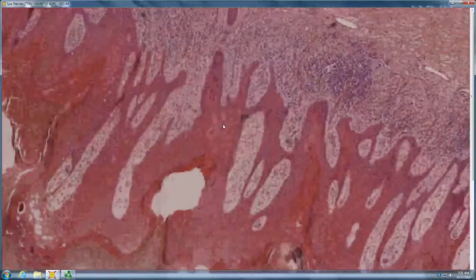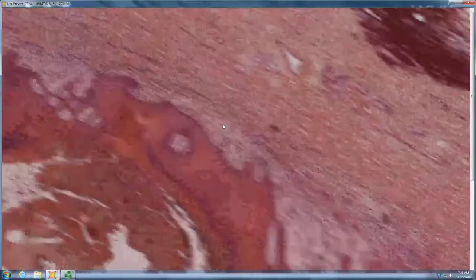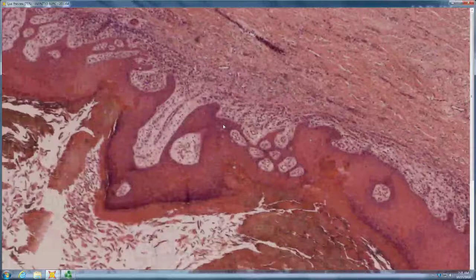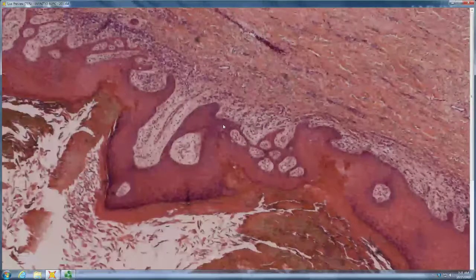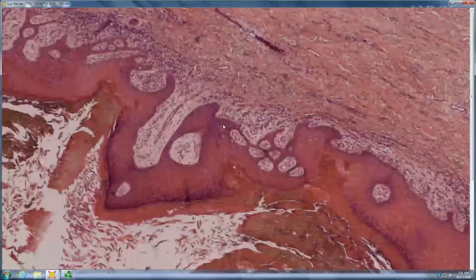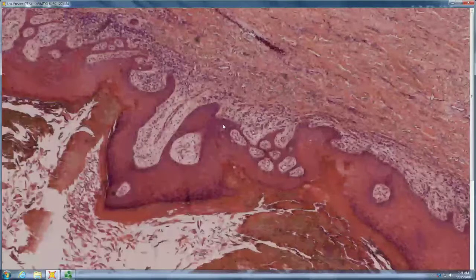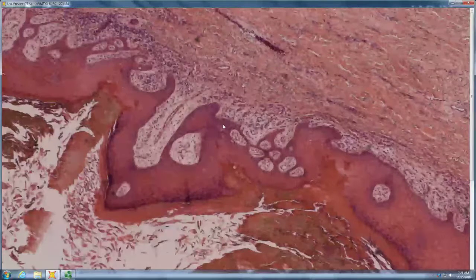Maybe it's like porokeratosis ptychotropica. Ptychotropica, that's exactly what it is. So porokeratosis ptychotropica, we've seen patients here with it. It's often a brownish gray fixed psoriasiform plaque on the buttock. And histologically, it has massive hyperkeratosis, pseudoepitheliomatous hyperplasia, and a million cornoid lamellae all lined up.